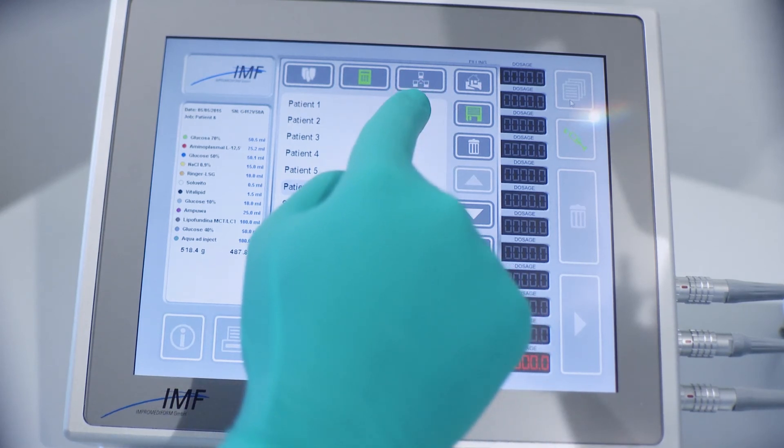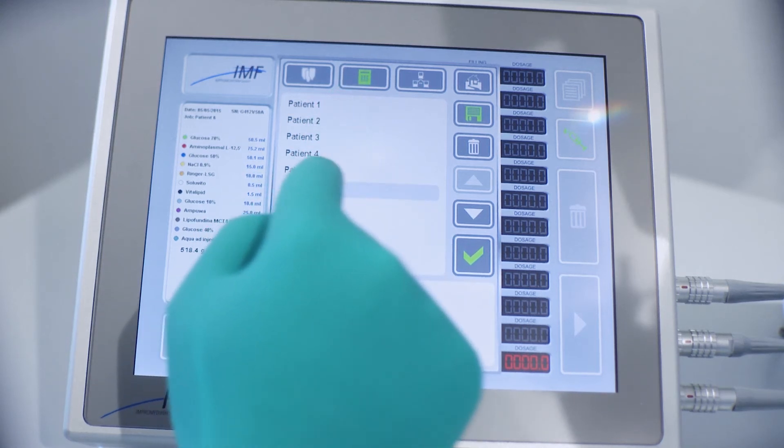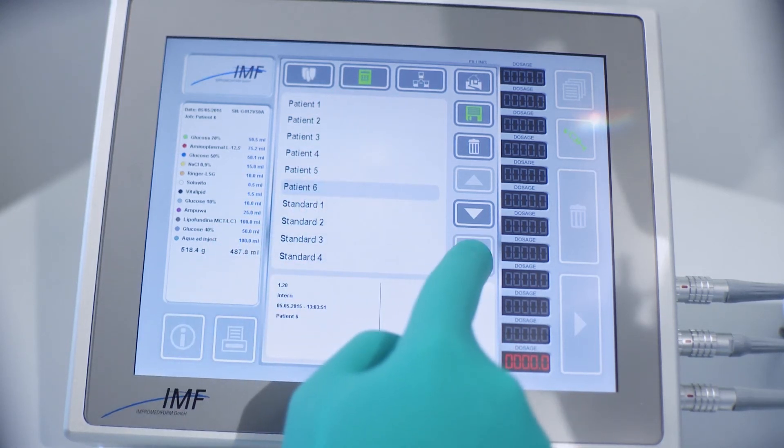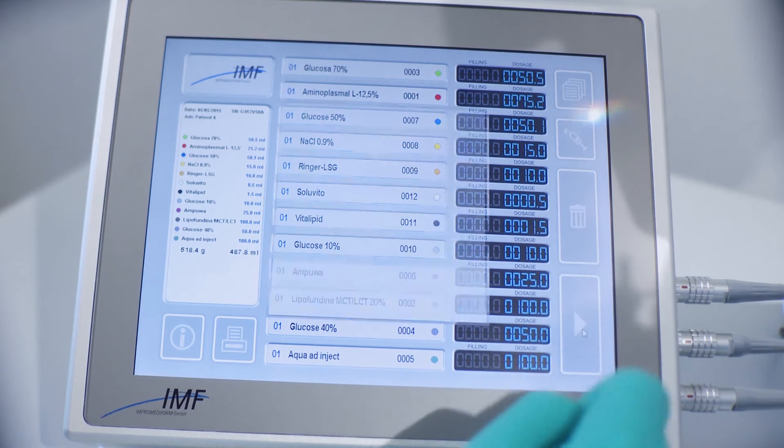One for the external jobs, for the formulations coming from an order entry software, and one for the internal jobs, standard formulations entered directly from the touch screen of the Medimix multi and saved for future use. Select the right formulation and press next. The volumes of each ingredient will be displayed on the main part of the screen and on the left side, as well as any possible manual additions.